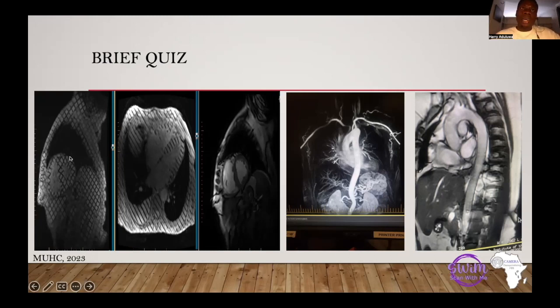Now, I had to ask a cardiologist, I can run this. It's just a basic sequence on the MRI system where you just need to copy either your four chamber or your short axis mid and run it. It will give you something like this. Nothing really much about it. But what is important when it comes to cardiac imaging for radiographers?